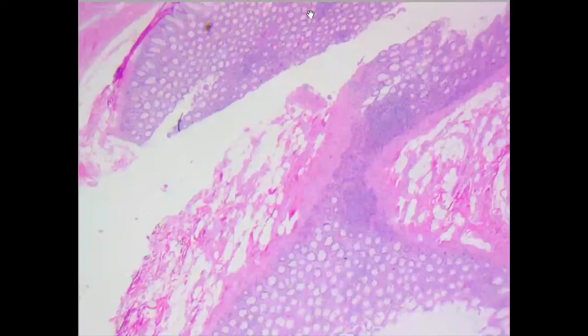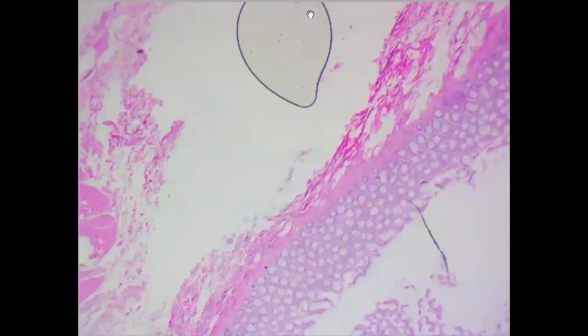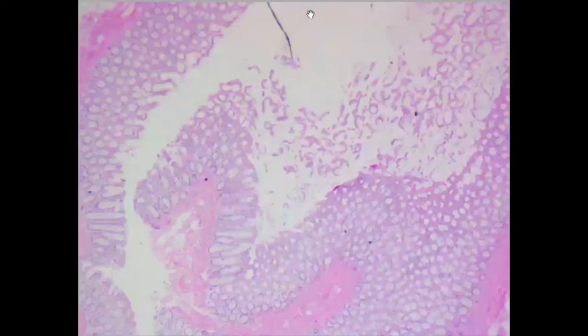This is another slide. Let's go directly to the pathology here. We are at 2.5x. So this is the muscularis propria. You can see it's a huge one, and this is where we have the mucosa and the submucosa, and let's see how deep they will go. So this is the muscularis propria.